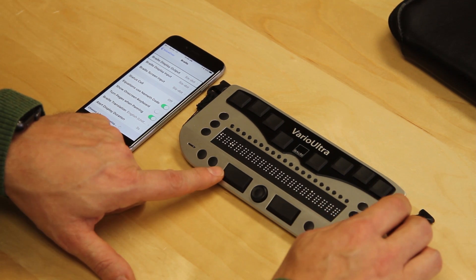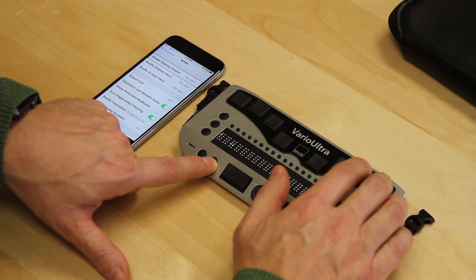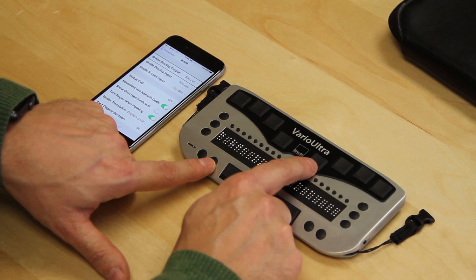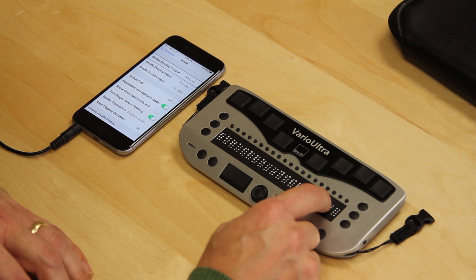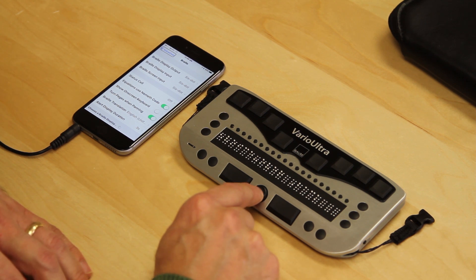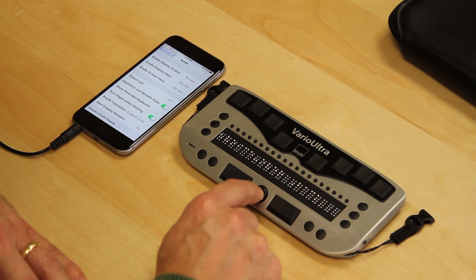On the Vario Ultra, I use S2 — System Button 2 — and press B4 for Channel 1. It comes up with BT1 BaumUSA on the Braille display. Now, if I use the NaviStick to the left, I'm controlling the phone without having to touch it. The phone could potentially be in my pocket or bag; as long as it's in Bluetooth range, it's going to work.